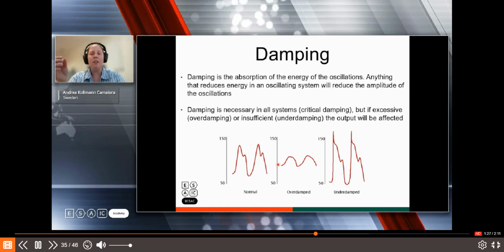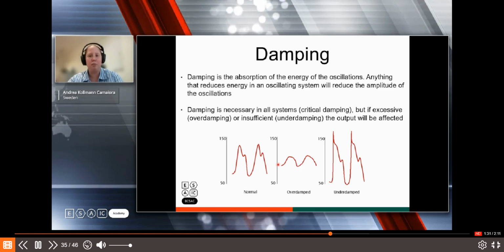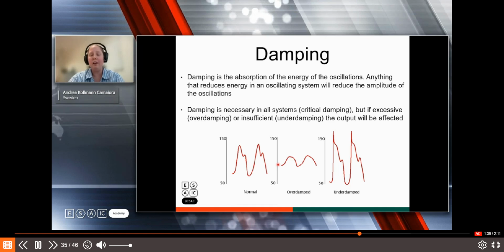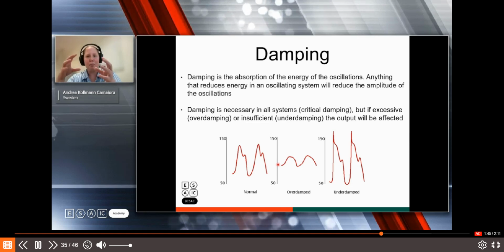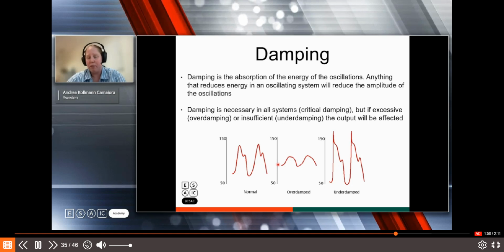And it's harder so that the pressure is not lost during the transmission of energy. But if you put an IV line cable instead of an arterial cable, IV lines are much softer. And then with this oscillation, the pressure will be lost in the system. And then you get an over damping effect.